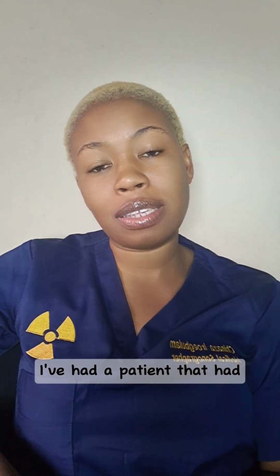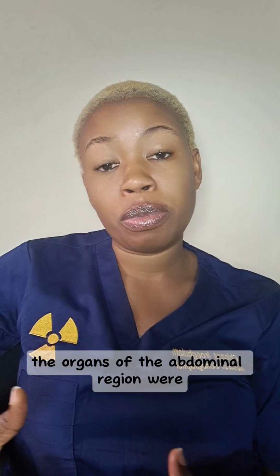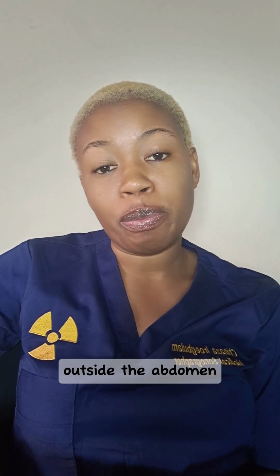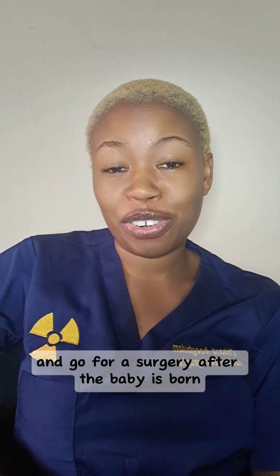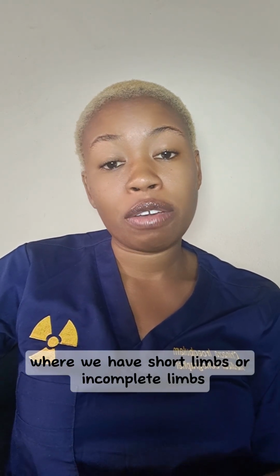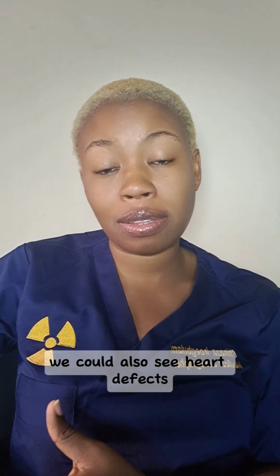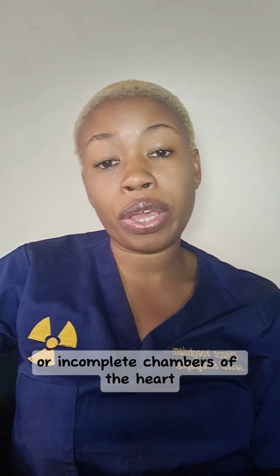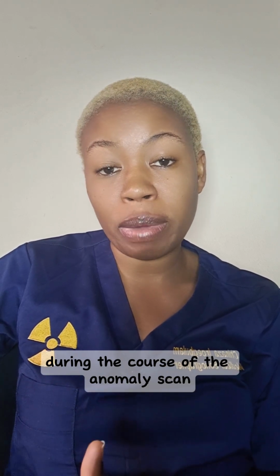I've had a patient that had a baby with an abdominal wall defect. The organs of the abdominal region were outside the abdomen. But she decided to keep the baby and go for a surgery after the baby is born. We could also see limb deformities, where we have short limbs or incomplete limbs. We could also see heart defects, where we have holes in the heart or incomplete chambers of the heart. These are the complications we could see during the course of the anomaly scan.